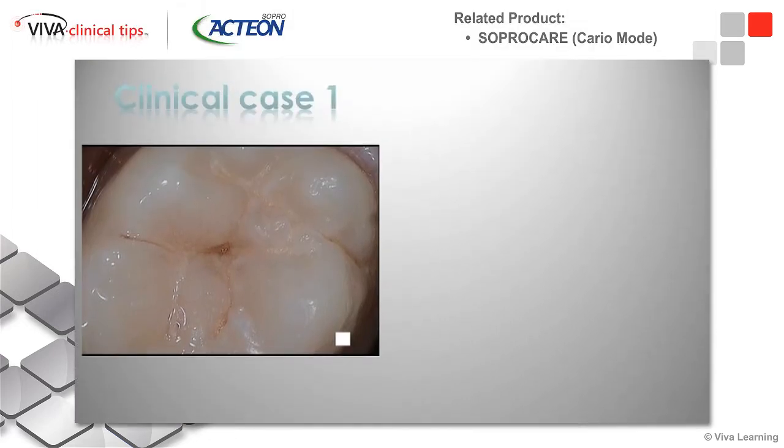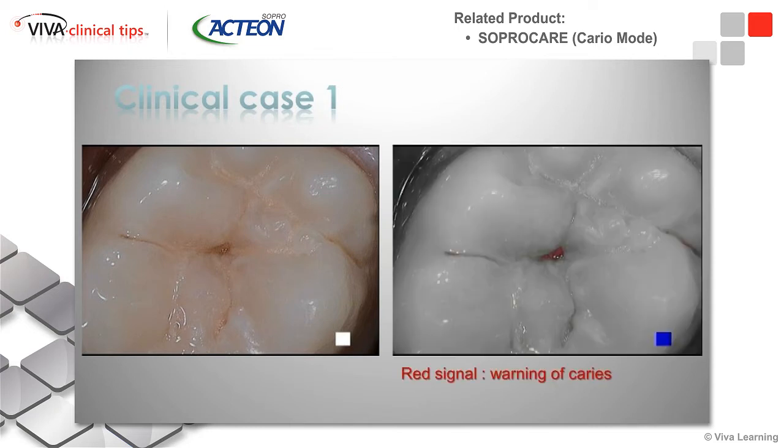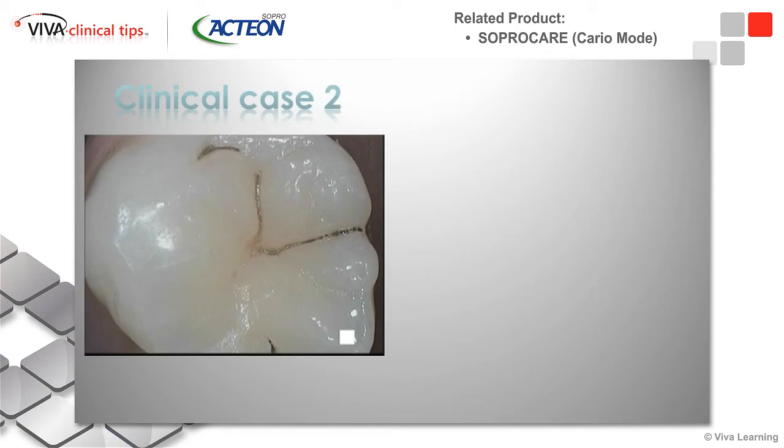Clinical case 1, the first photo in the next 5 slides is just going to be 110 magnification. And then you can see here when you put it on the caries mode, the mouth turns black and white, and you can see right in the middle there a tiny bit of caries.